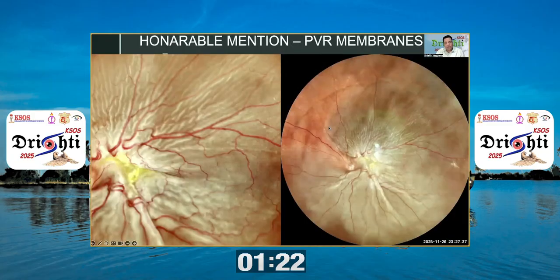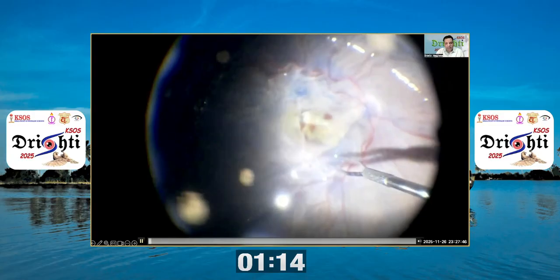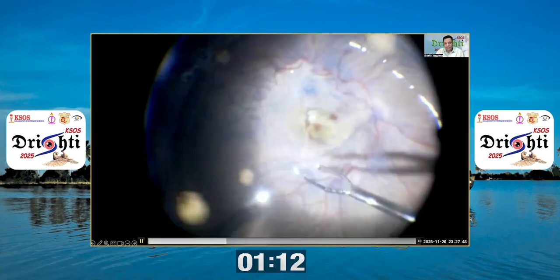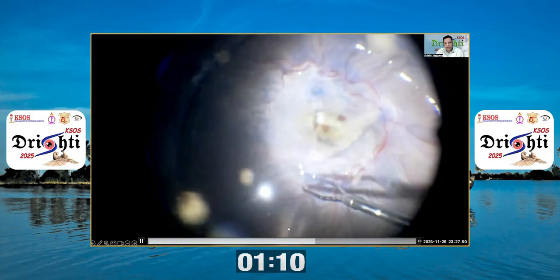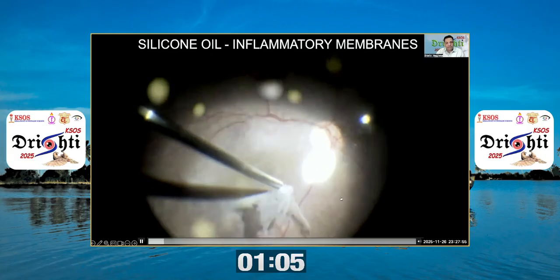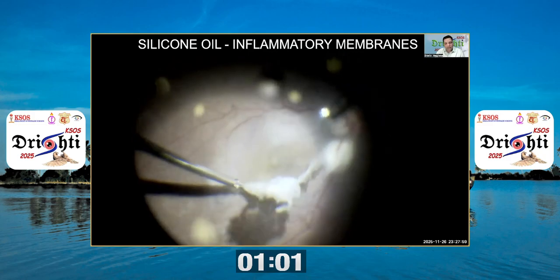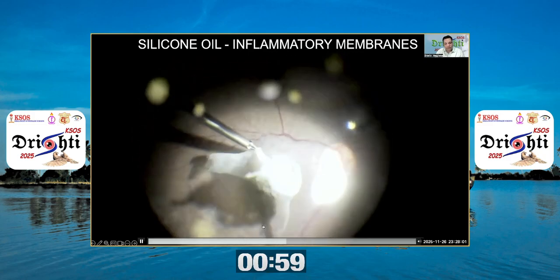And just a slide on some honorable mentions. Even membranes can present at the macula in the form of a proliferative vitreoretinopathy in cases with retinal detachment. So here you can see in this case, I'm removing these PVR membranes from the posterior pole. And another honorable mention, sometimes when you leave silicone oil inside the eye for too long, you can have these inflammatory membranes which develop.